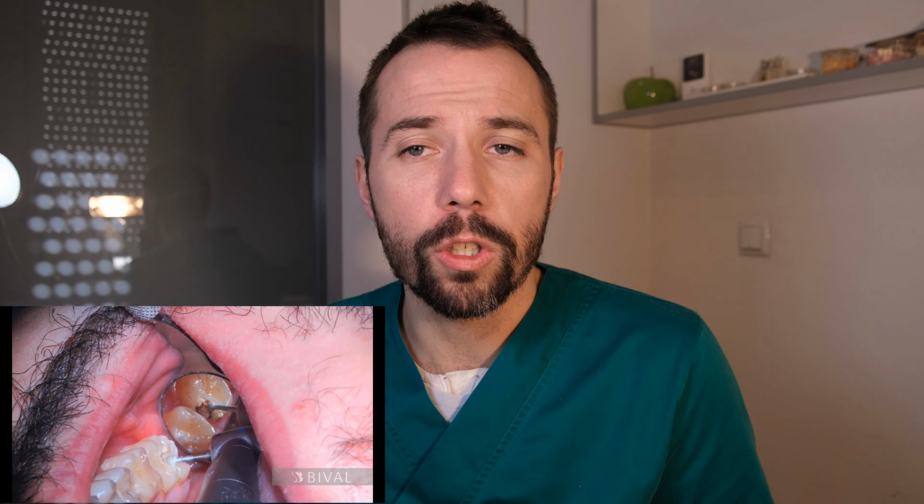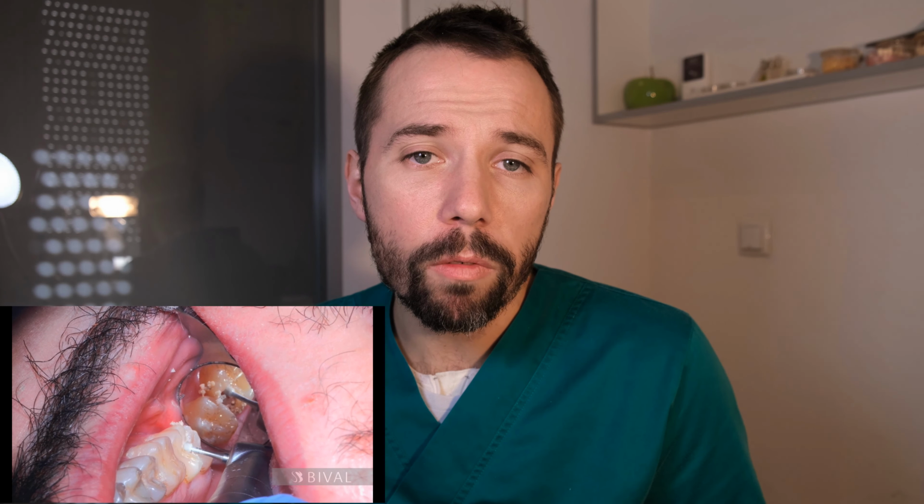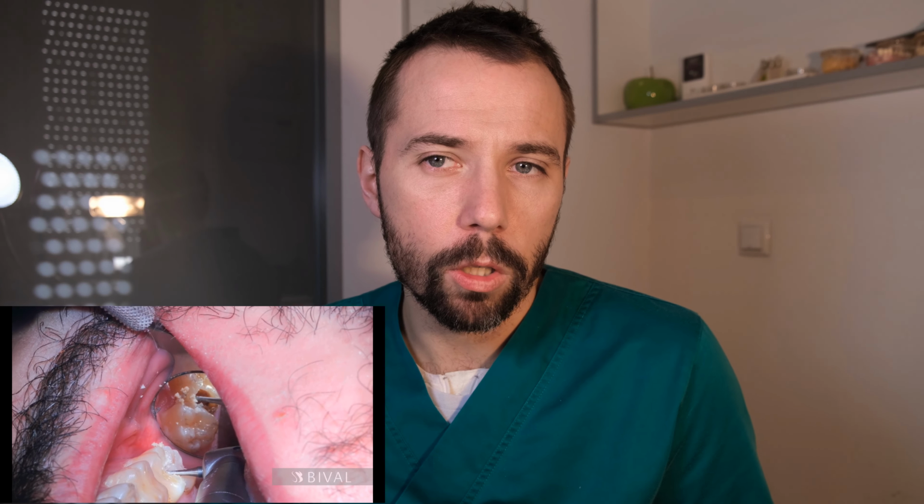If you want to learn more about tooth decay, tooth caries and tooth cavities, you should check my video regarding that topic. And so let's continue. Today we have several types of different materials for fillings. We have restorations that can be done directly in the mouth, called direct restorations, and restorations that can be done in the laboratory, which are called indirect restorations. All of them have their pros and cons. We're going to talk about them now.